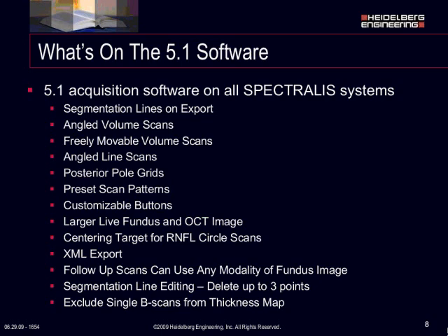The next thing is the segmentation lines are also editable down to 3 points. If you want to change the segmentation line, you previously had to right-click on the line and then either add a point or delete a point to move it. Now you can right-click on that line and delete all but up to 3 points, and then just move the line from there and add points in as you see fit.